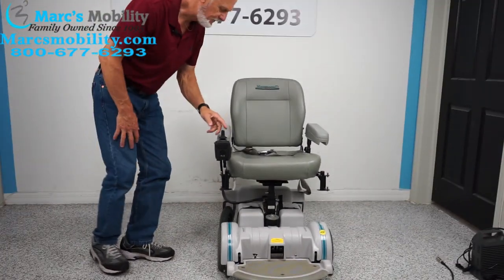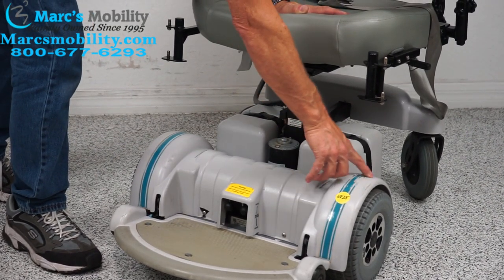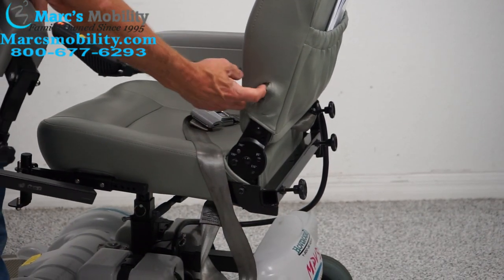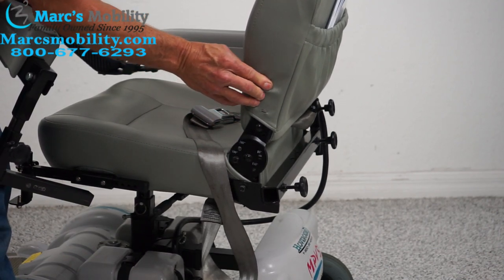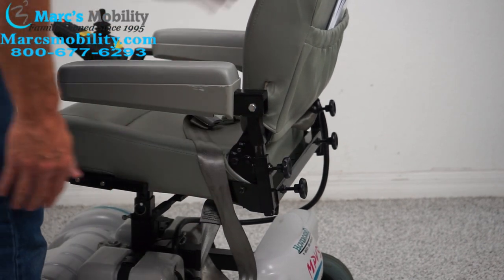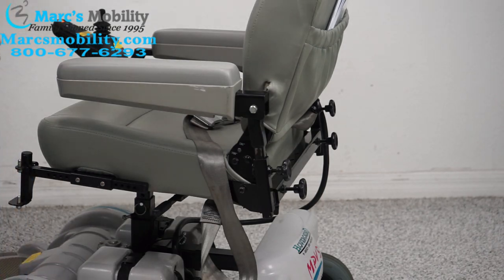A couple of things about this power chair: the gentleman who had it was a terrible driver. On the fender right here, he scraped the top of the fender — he probably went under a table. Right here there's a tear in the seat; I'll sew it together so you won't even see the gap. The reason it happened is he had the arms way too tight, and this bolt would pull the seat material every time the seat came down. We'll fix that. We're not going to replace the seat because it's way too expensive, and it only has 50 hours on it — it's like new. The seat is 20 inches wide by 18 inches deep.